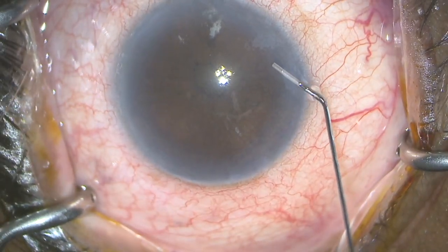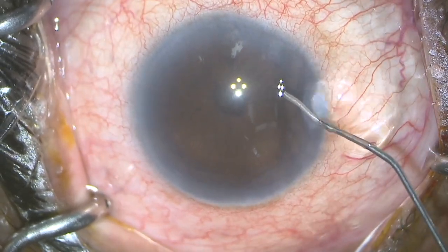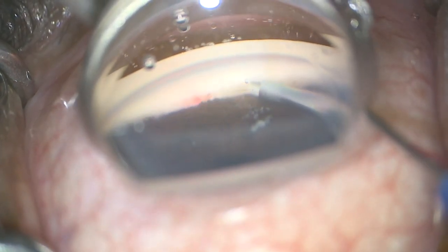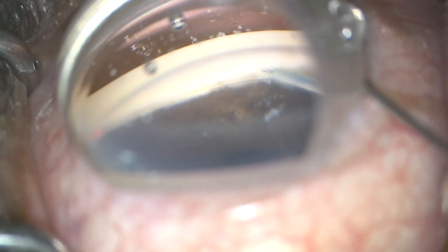A paracentesis was made infratemporally and flared towards the nasal angle. Lidocaine and miostat were injected into the AC, and the AC was filled with Healon Pro. The iTrack Advance was inserted into the AC. The spatulated cannula tip was used to score the nasal TM, and the actuator was pushed forward to advance the catheter into Schlemm's canal. The blinking red light at the tip of the catheter can be seen.